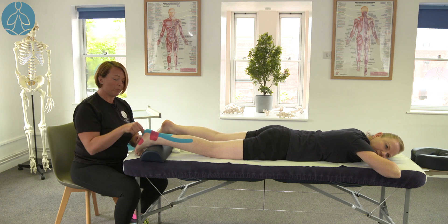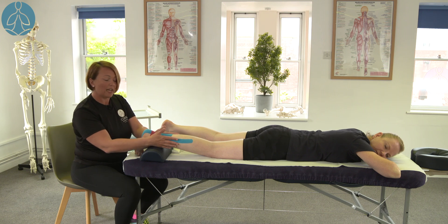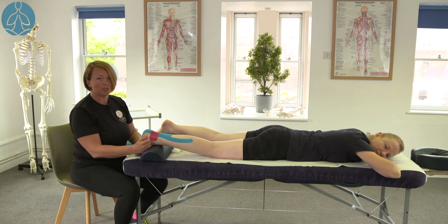We've shown an eye strip, a decompression strip, and an eye strip that has been split into two — which again, if the client has a larger leg, you can use two full eye strips for further support.